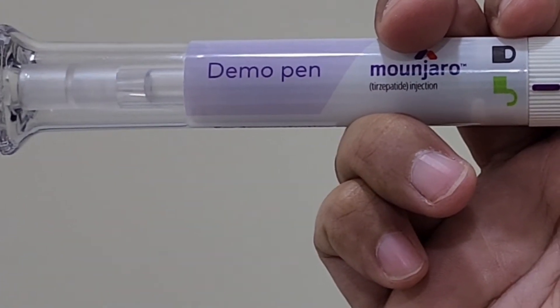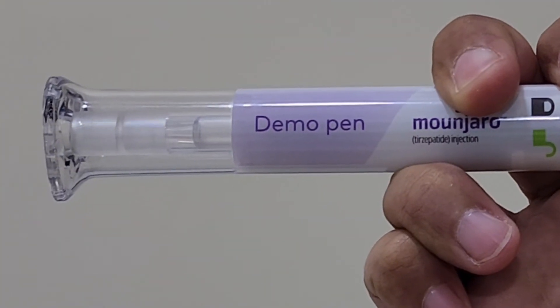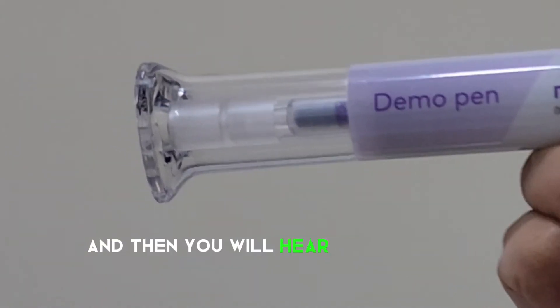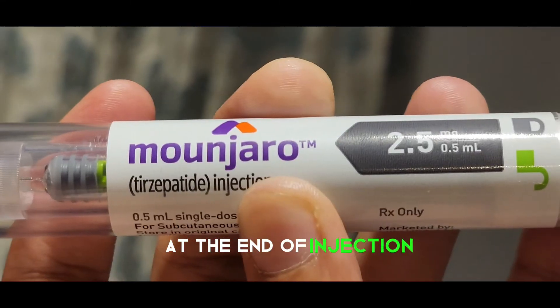You only have to press the button once. You will hear one click, which takes the needle in, and then you will hear a second click, which takes the needle out.